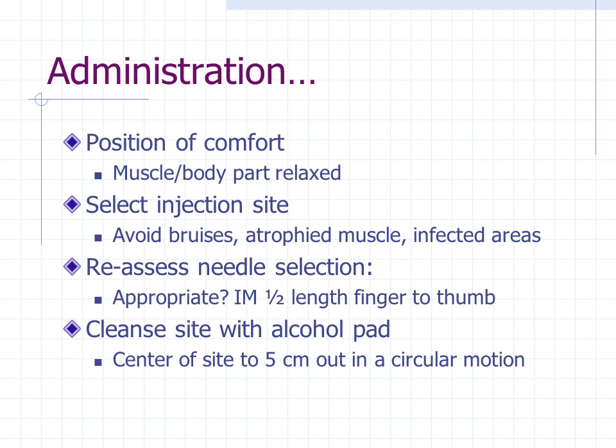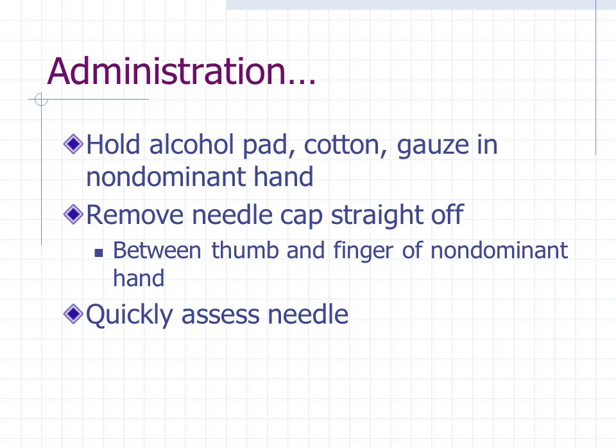Cleanse the site with an alcohol pad. Go from the center of the site to 5 centimeters out in a circular motion. Place the alcohol pad or cotton or gauze in your non-dominant hand.